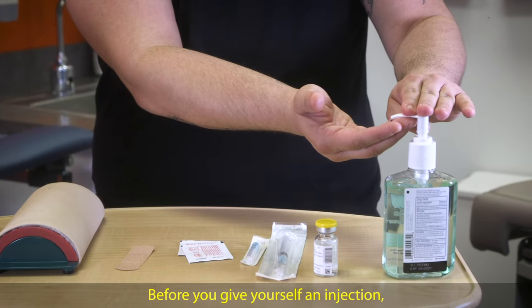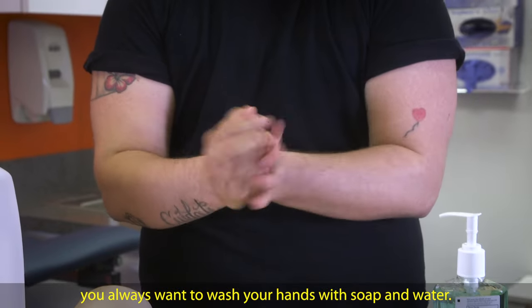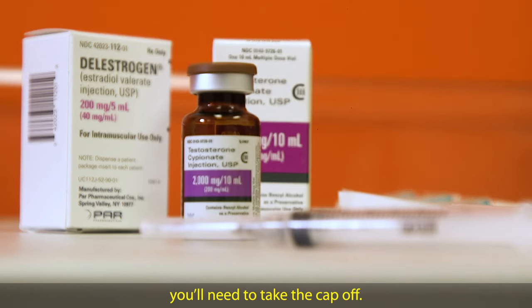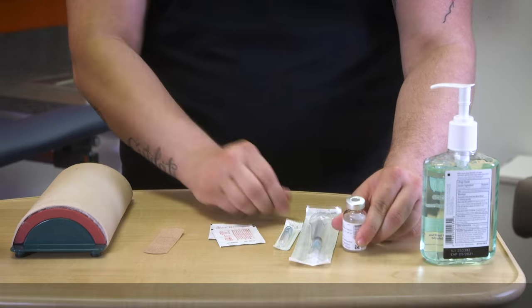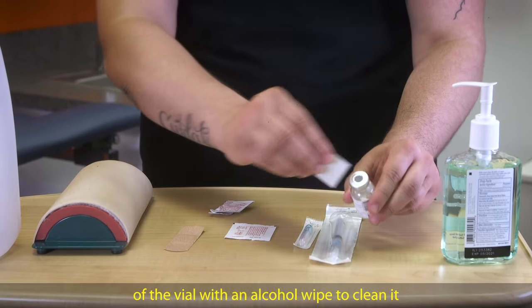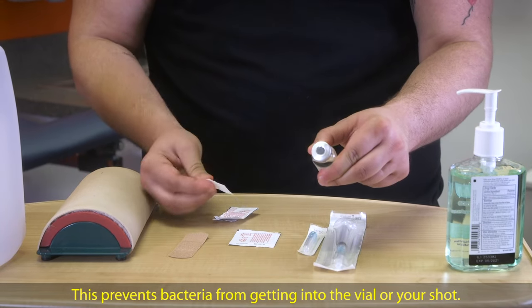Before you give yourself an injection, you always want to wash your hands with soap and water. If you have a new vial of hormones, you'll need to take the cap off. This cap shows you that the vial is brand new and has never been used. Then you want to scrub the center of the vial with an alcohol wipe to clean it. This prevents bacteria from getting into the vial or your shot.